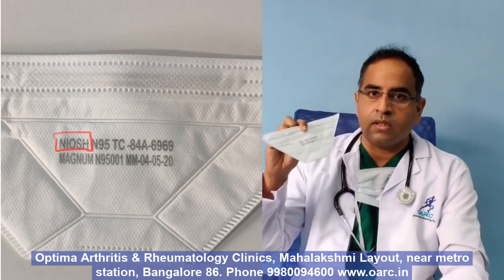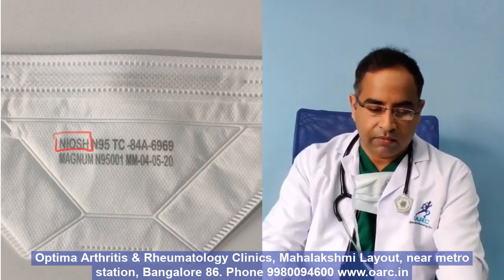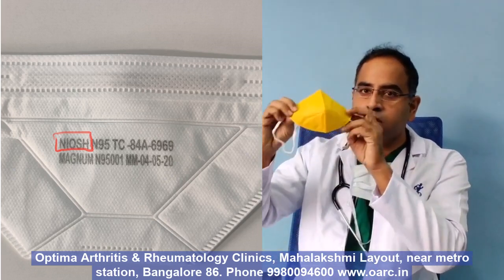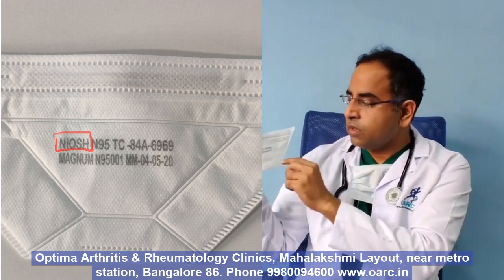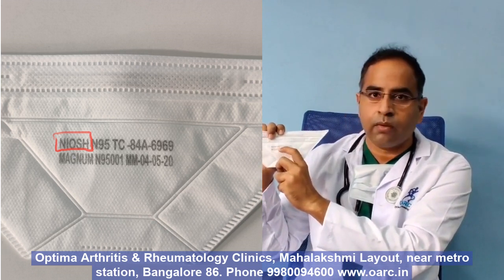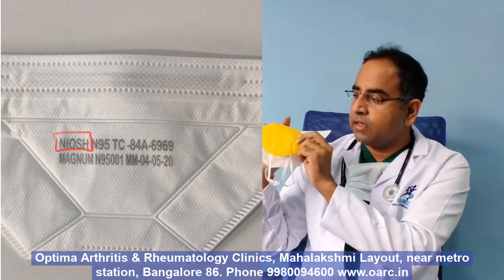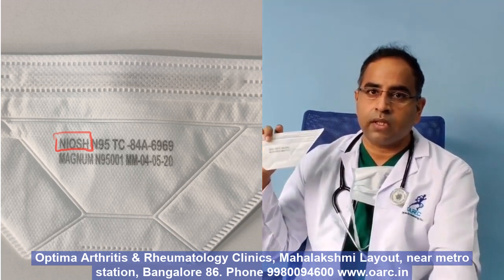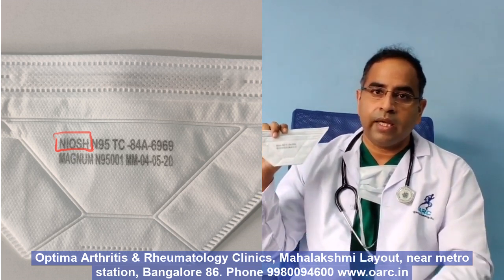The most important thing you need to see is that in an original N95, there will always be certain markings. Whereas in a fake N95, it will be empty — you can see there are no markings on this fake N95. The original N95 will have something called NIOSH mentioned, whereas a fake N95 will have nothing called NIOSH mentioned. And even if it is mentioned, it will be spelled wrong — it might be spelled as N-O-I-S-H or N-O-I-HS.